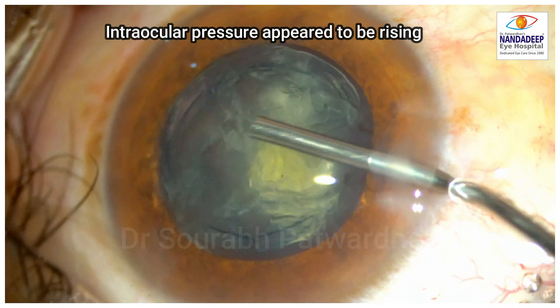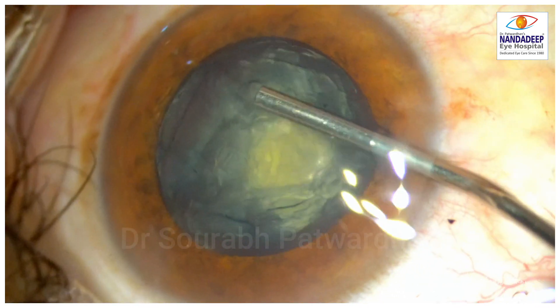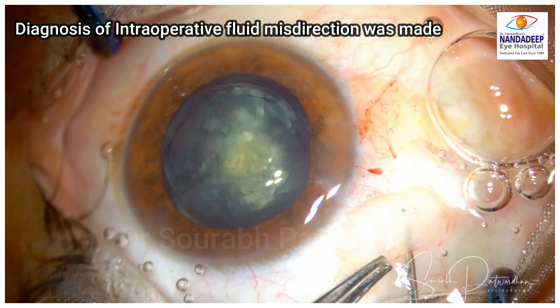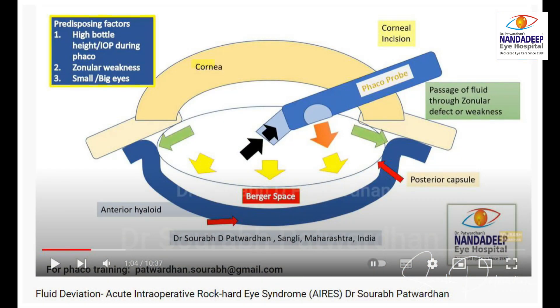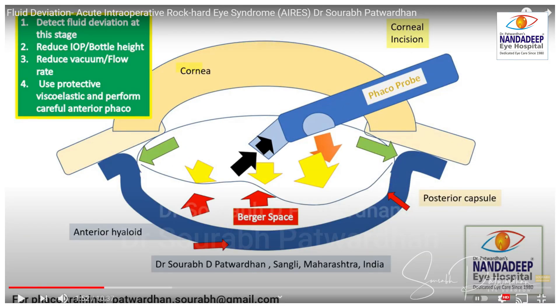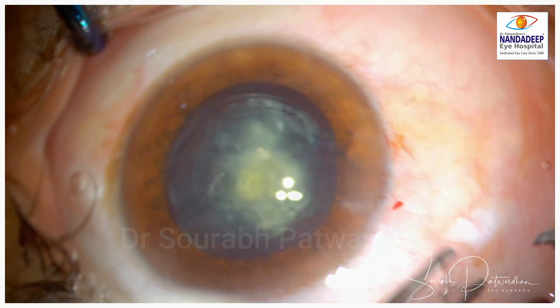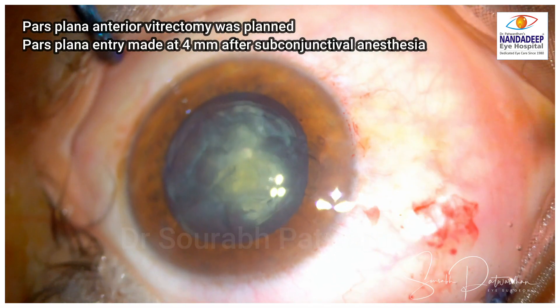I tried to tap the nucleus, thinking there might be fluid trapped in the back to burp it out, but that was not the case. I made the diagnosis of intraoperative fluid misdirection. For more on this, you can watch my video on fluid deviation. Basically, the fluid was trapped in the Berger space behind the posterior capsule.